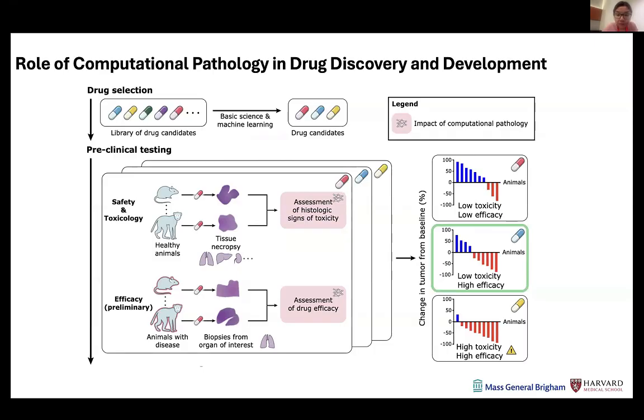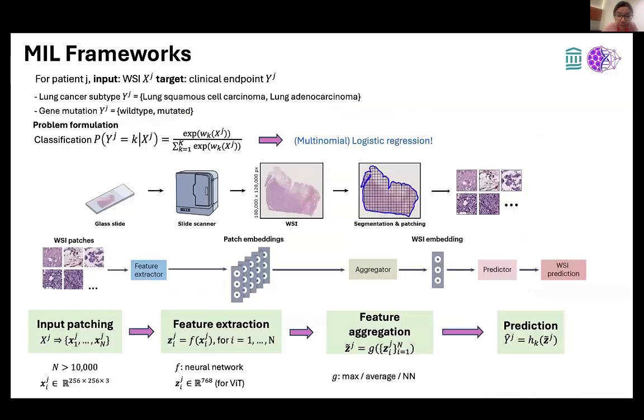So human diagnostics is just a part of it, but looking at these glass slides, we also analyze toxicology, analyzing which compounds are fit for moving on to different kinds of trials. So this has also been a phase of interest to us.